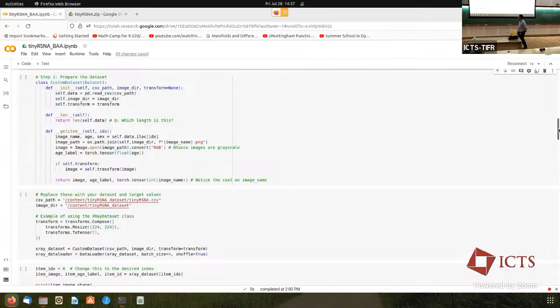So remember, I showed you that image earlier. Can anyone tell me what caveat there might be in doing this? It seems easy enough and you would just do it, but you'll run into trouble. Why? We just did it when we first did it, and then we realized a couple of days later that, oops, that's not what we should have done. Can anyone guess why we went wrong? You don't want to import your image just like that and resize it to 224. Aspect ratio will be destroyed, right? So you want to retain aspect ratio, in which case you pad appropriately the right dimension.